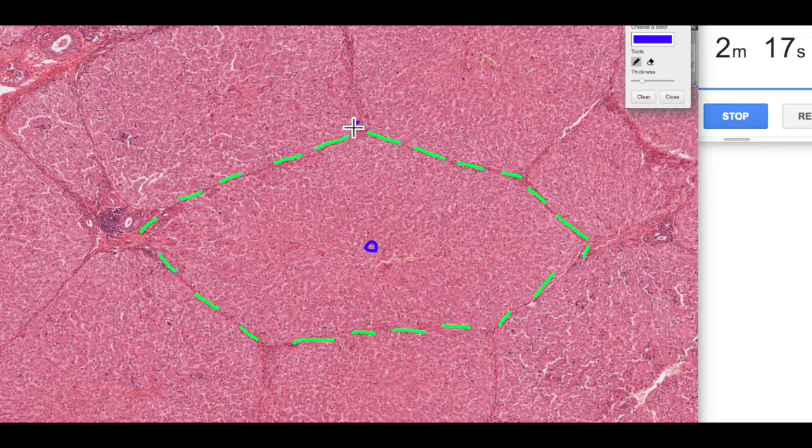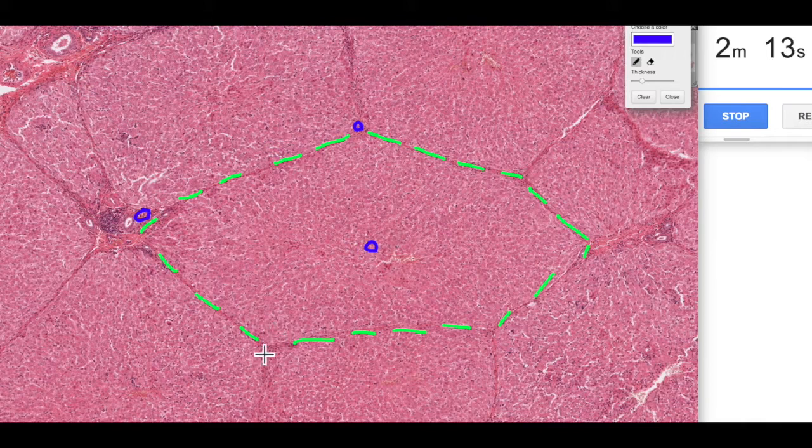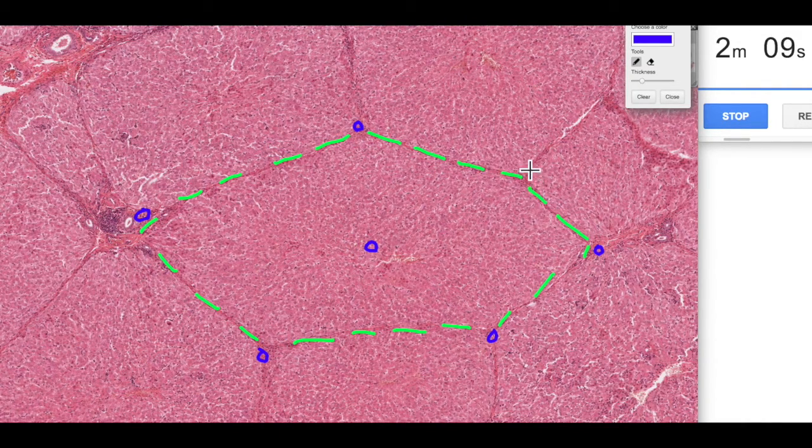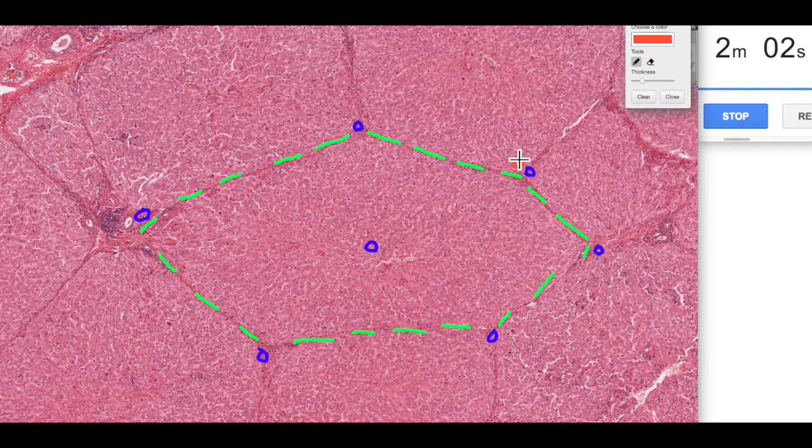Within the portal regions and the portal triads, we have our branches of the hepatic portal vein, which I'm indicating in blue here. We also have, remembering we have a dual blood supply in the liver, branches of our hepatic arteries.